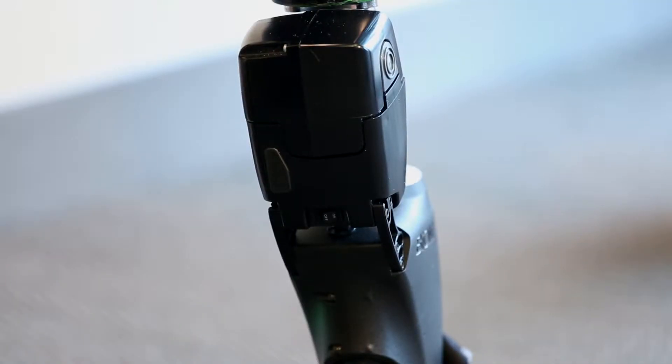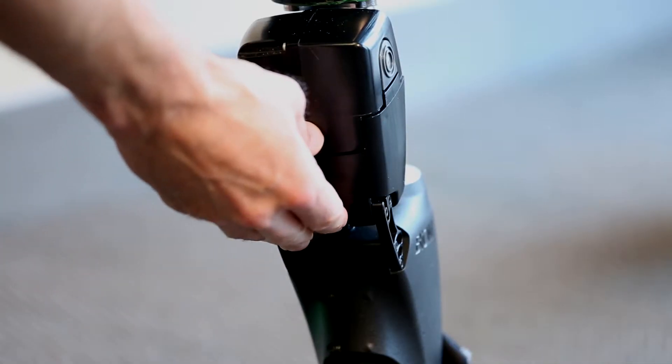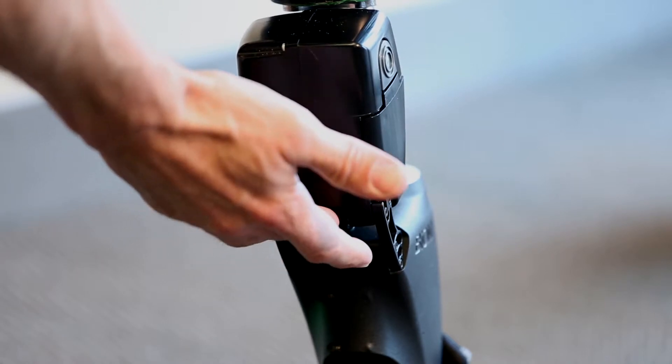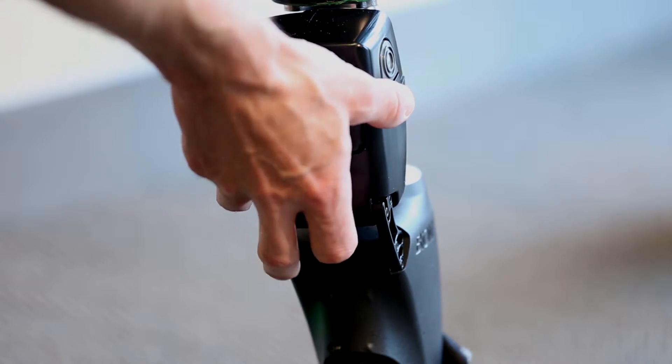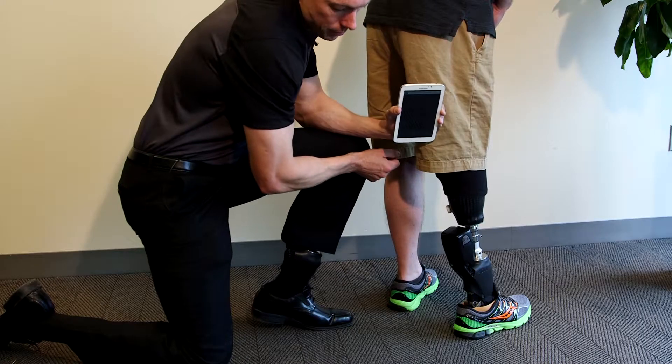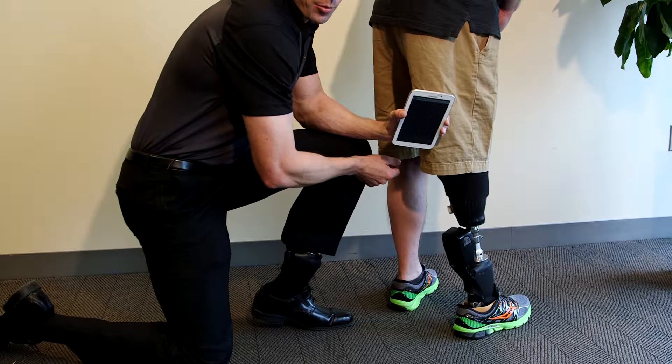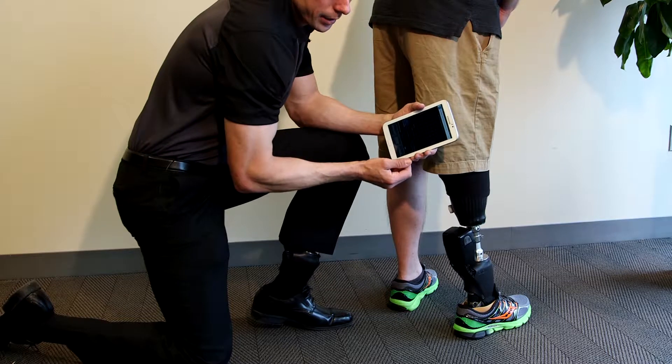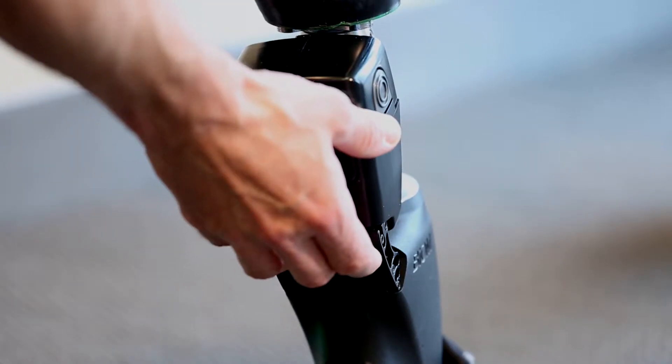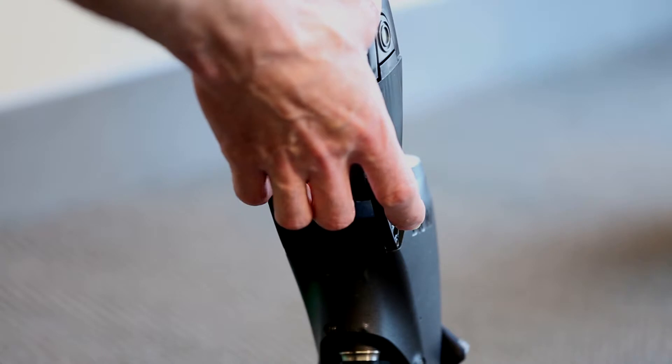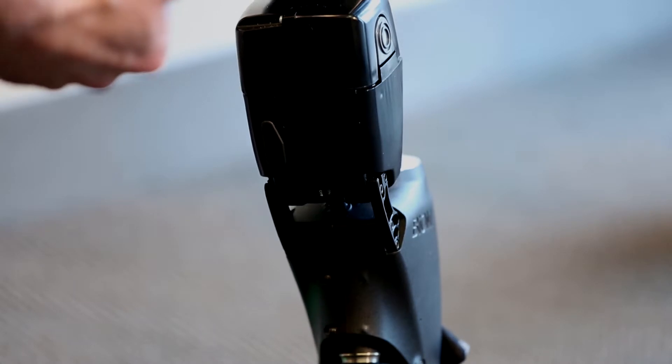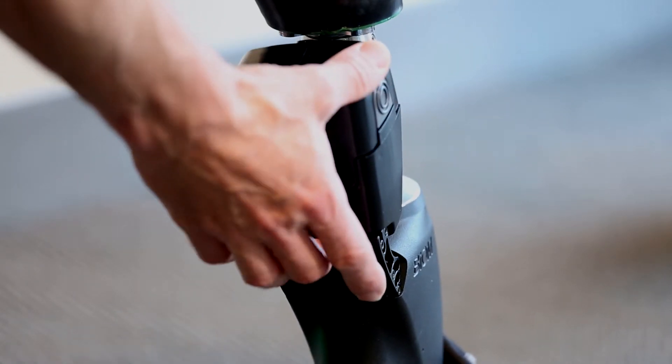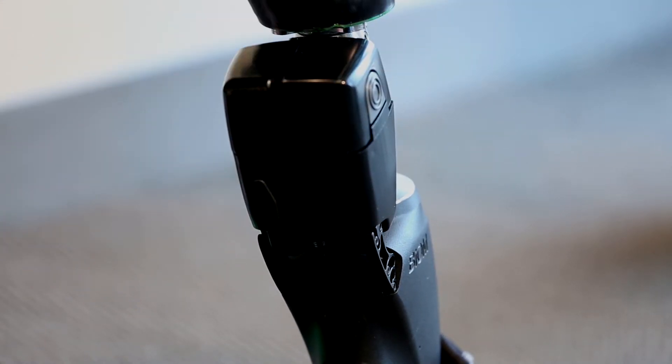In order to connect to the biome and tune it, we first have to power the system up. The power switch is located on the back lower section of the lithium polymer battery. It's just a small flip switch that we see here. To power up, we flip the switch to the right, and we hear a singular calibration beep. That beep assures us that the ankle has calibrated and powered up successfully. It turns the Bluetooth on, and at that point, we can connect with the tablet and proceed with the tuning. Now, the only other time you may not hear a calibration beep would be if the patient has too much weight on the toe when you power the ankle on. When that happens, we'll hear these successive low tone beeps that tells us that there's too much pressure on the toe. We would instruct the patient to unload the toe at that point, and then we should hear the ankle calibrate normally.